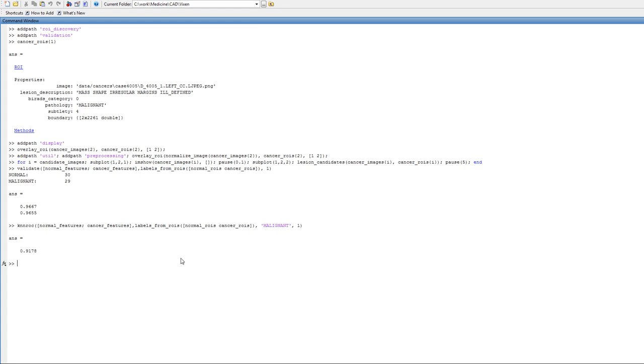So yeah, those are the internals of Digital Mammographer. We have a lot of other functions that contribute to this. I'm not going to show you how they work. That's proprietary. But this is the summary. This is how the magic happens.